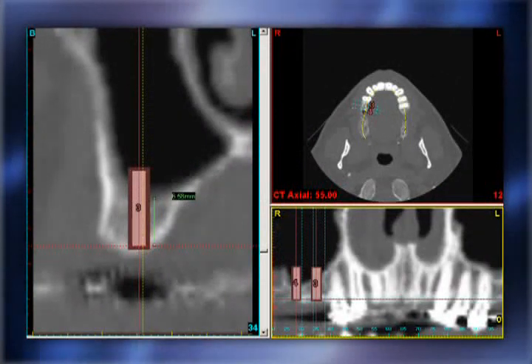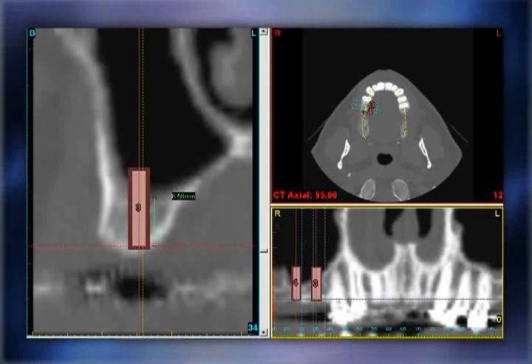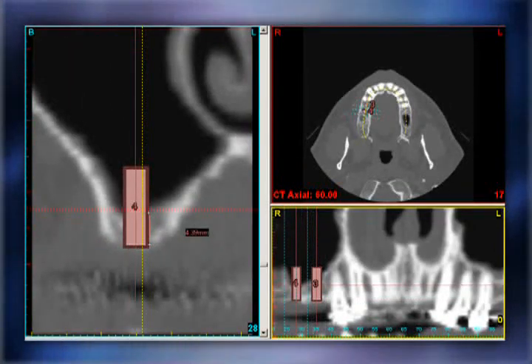The diagnostic records in this case included a CT scan in order to be able to accurately assess the preoperative subantral bone levels at the intended implant sites. This CT scan indicated approximately 6 millimeters of subantral bone at the second premolar site and approximately 4 millimeters of subantral bone at the first molar site. Alveolar ridge widths were well beyond the minimum of 5 to 6 millimeters, while the bone density measurements in Hounsfield units indicated primarily cancellous bone.